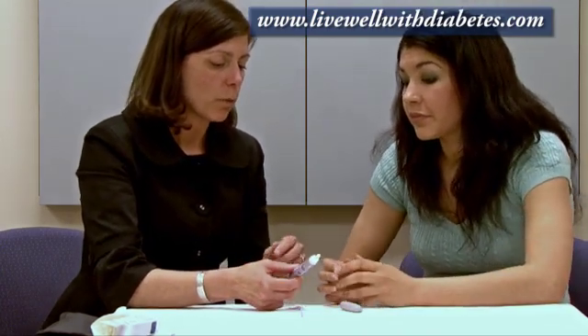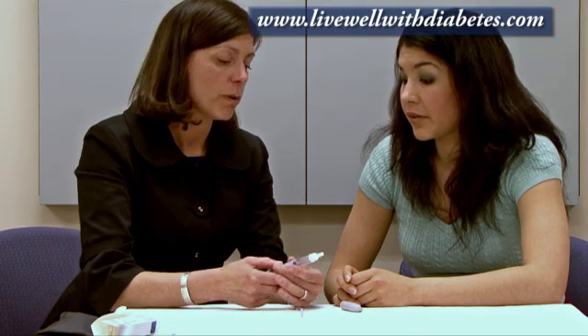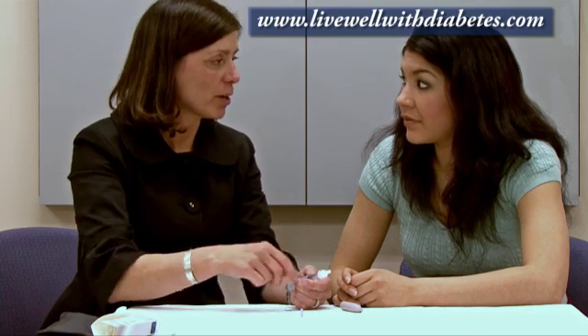What happens if I need 20 or 22 units and there's only 20 left? When you dial your dose, it will only dial up to how much insulin is left. So if there's only 20 units left and you need 22, you turn it up to 20, inject it, then start a brand new pen and take the remaining two units from that pen — meaning two pokes that day. Some people like to use it to the last drop; others would rather just have one poke and waste whatever's left to start a brand new pen.